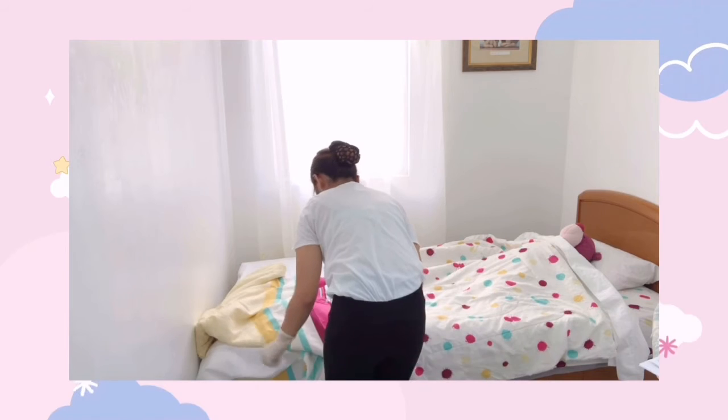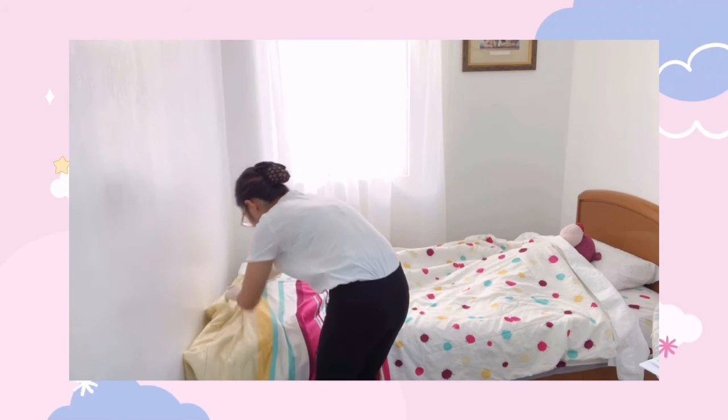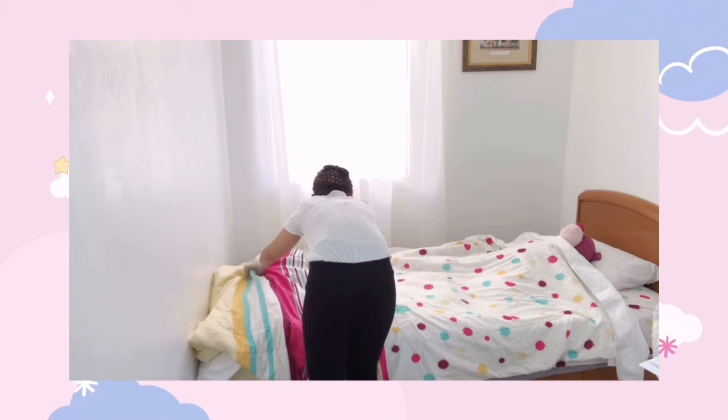Next, you're going to raise foot of the mattress and tuck the corner of the top sheet and blanket under. This secures the top sheet and blanket in place.